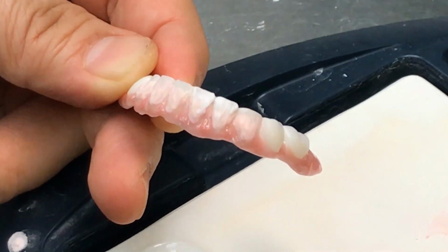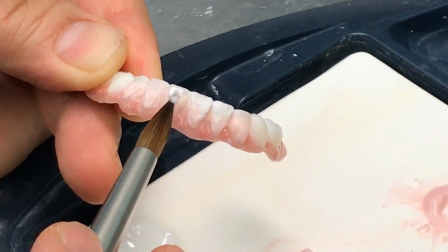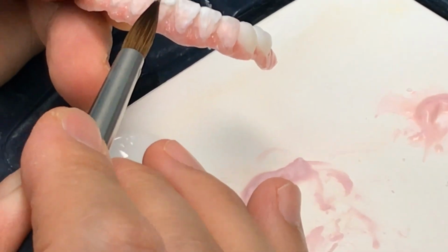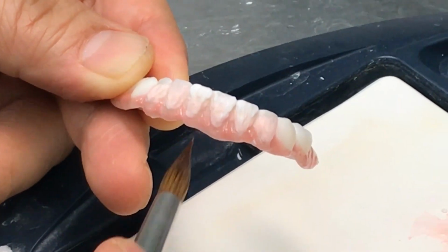However, I want to make a little bit better enamel overlay on the facial. It's very unique to build up. I don't make it too big, I don't make it too small. It looks like the tooth set up.